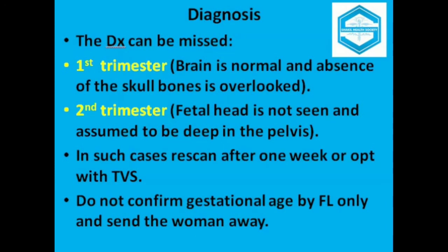The diagnosis can be missed in the first trimester — it may be overlooked because the brain appears normal while the vault is absent. In the second trimester, the fetal head is not seen and may be assumed to be deep in the pelvis. In such cases, a rescan after one week is advised, or we should switch to a transvaginal scan.